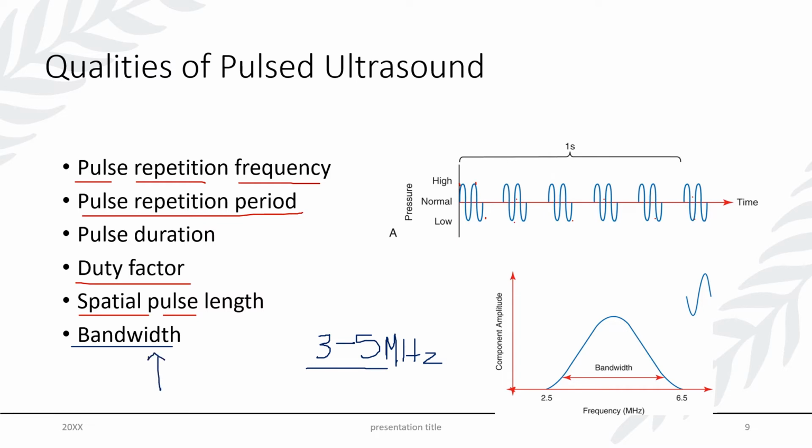that variety is referred to as the bandwidth. So here is a graph that gives a little further explanation of what bandwidth is. If my fundamental frequency range was 2.5 to 6.5, I have all of those options and I could image at any frequency in between. My bandwidth would be the difference between 6.5 and 2.5, or a bandwidth of 4.